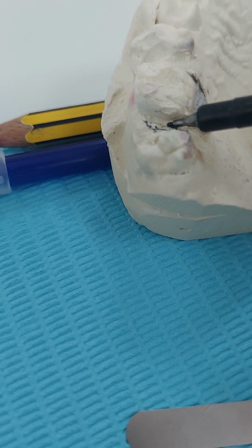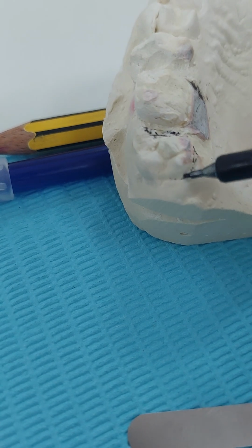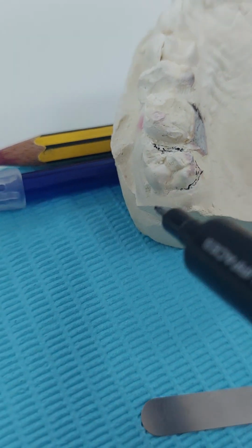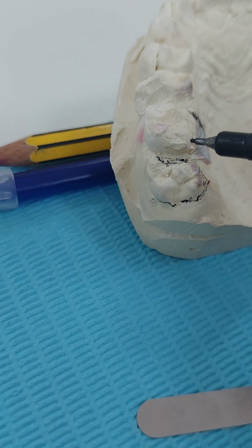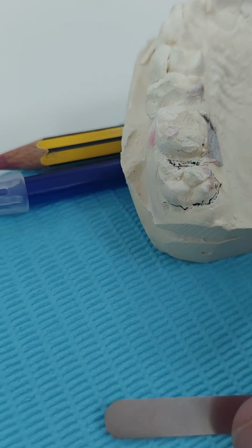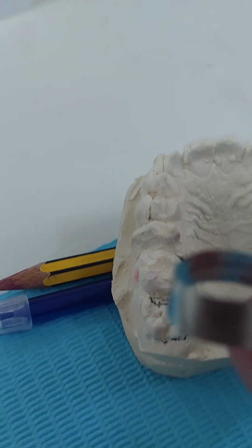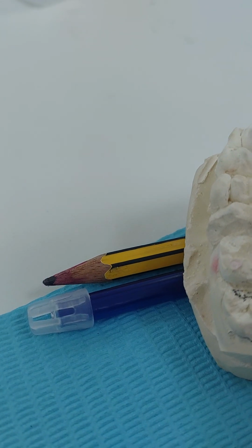This is just a cast model. I hope it shows the idea, but you will always suffer from this gingiva. So if I place the matrix as it is, it will not allow me to go deep here. So one of the methods, if I'm going to wrap this like this, I'm going to place the narrower area towards the gingiva. I'm supposed to do that.